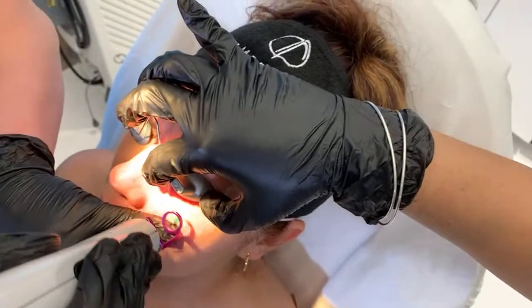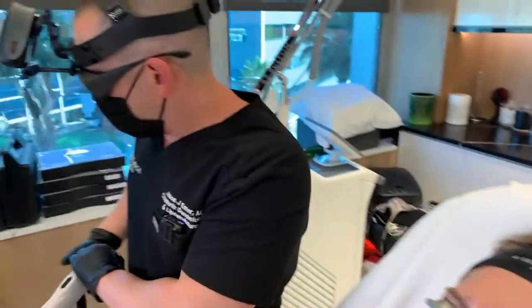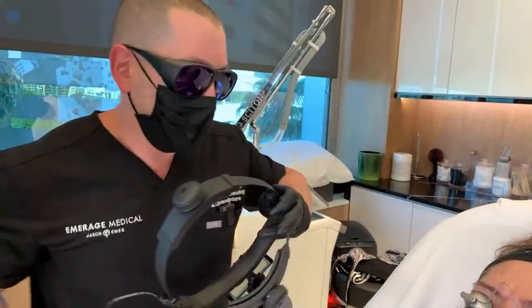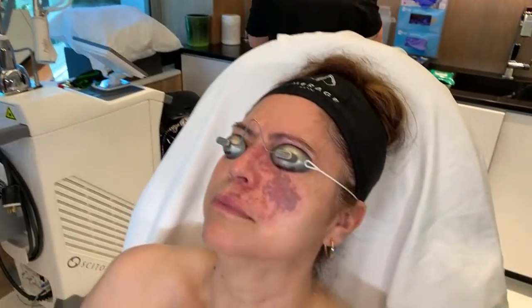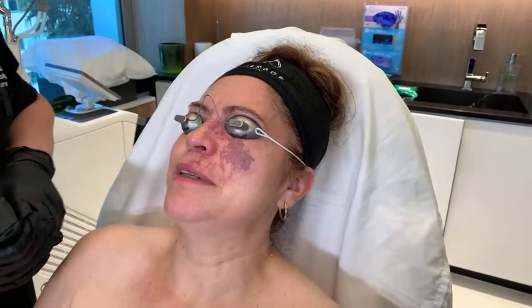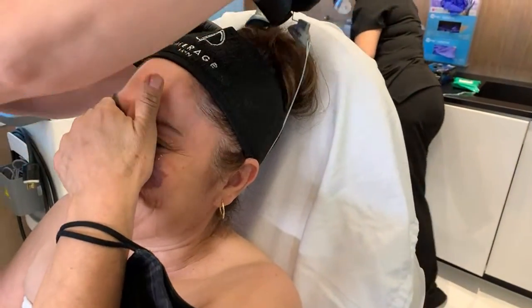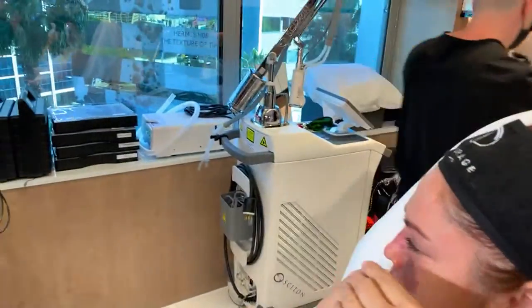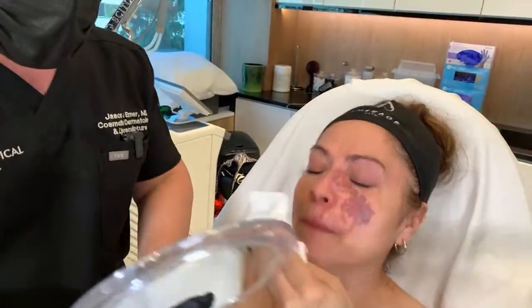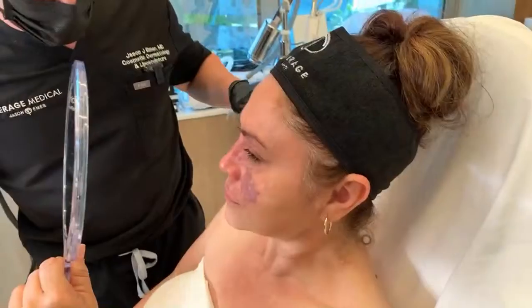We don't want to go too aggressive. How many treatments will she need? I'm hoping less than six — probably four to six. Let me take a look without my goggles now. This actually looks very, very good — this is perfect. So I want to show you guys: this is the anticipated outcome, actually better than I thought. You see how all of it has now turned to purple-black color?